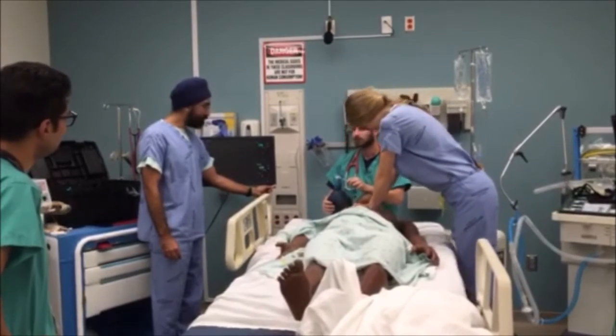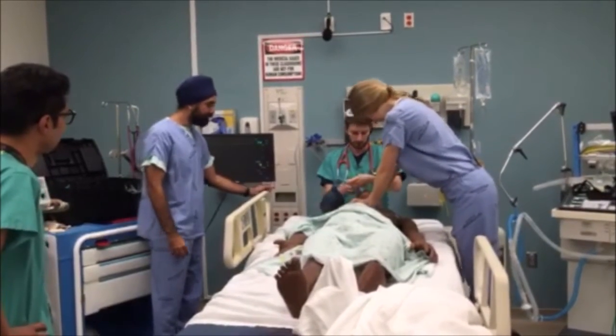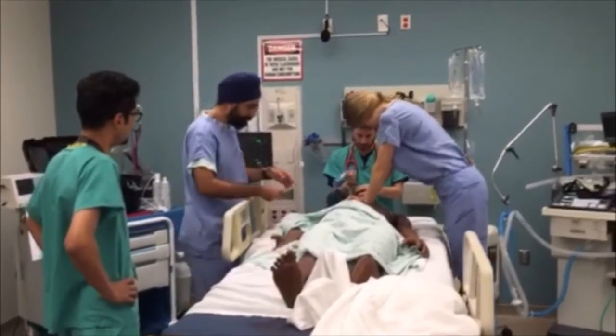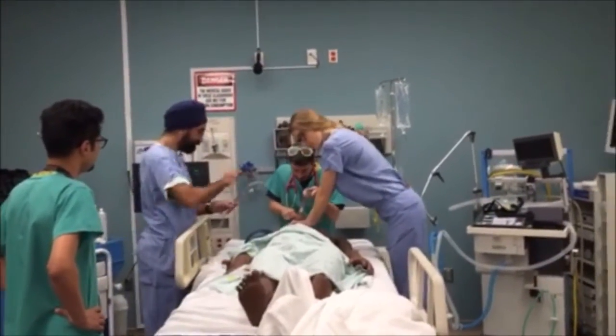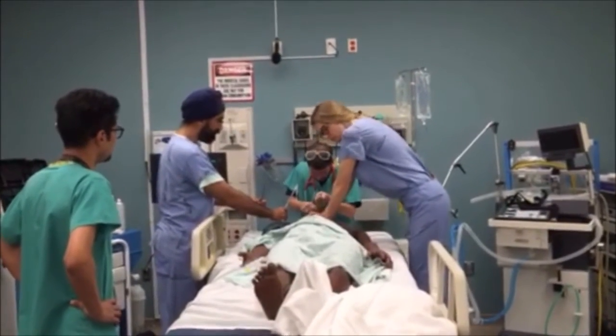The tube is not in place. Can we just take that tube out and put a new one, Dr. Calrissian? We can re-intubate the patient. Tube taken out. Nurse Coley, if you don't mind handing me the tube. Here you go, sir. Thank you.